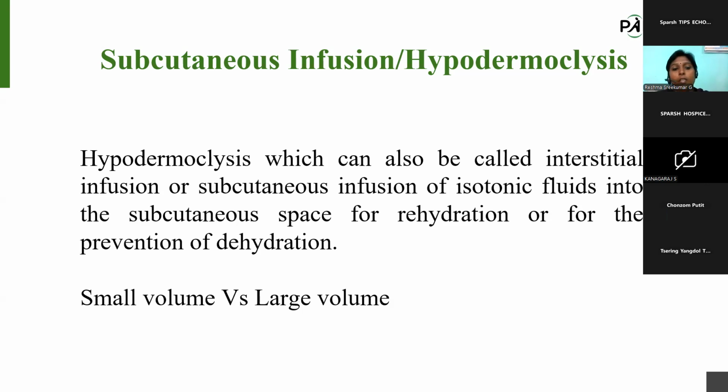Another point is we are giving subcutaneous infusions of isotonic fluids in the subcutaneous space mainly for rehydration purposes and to prevent dehydration. The main point is we cannot introduce a larger volume.